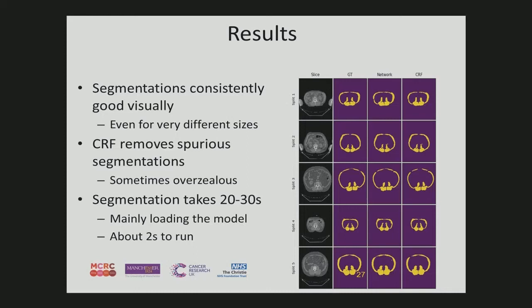Question: Do you know how this sort of segmentation lines up with the manual one? Yeah, well, it was trained on the manual ones, and we have the data very well, but I don't know it by heart how well.